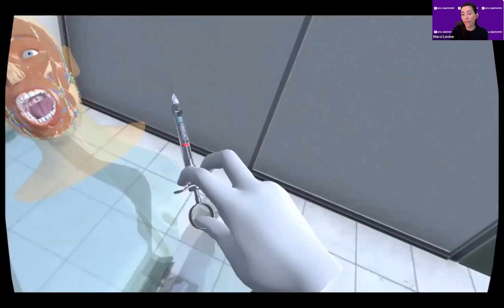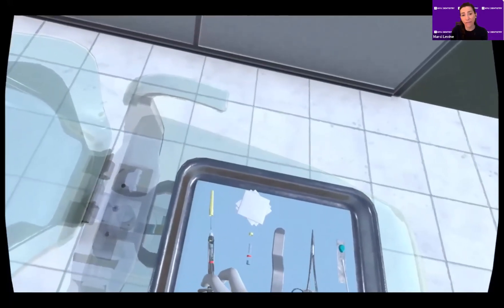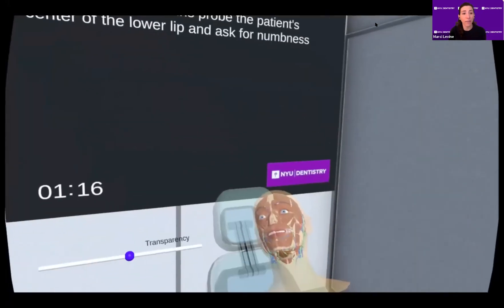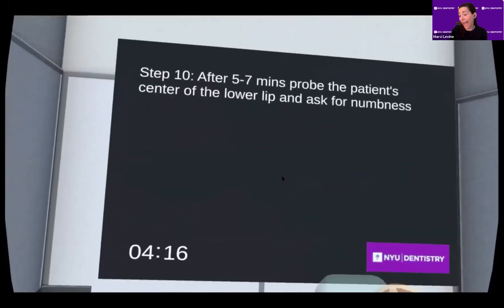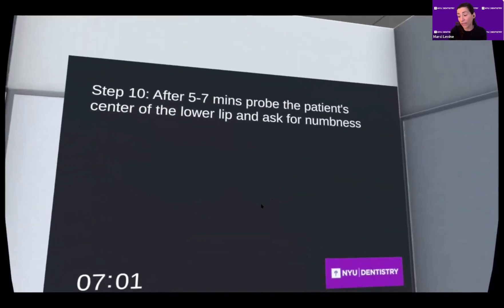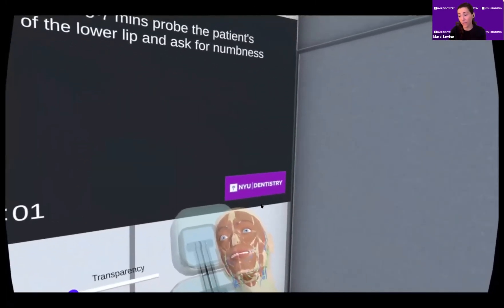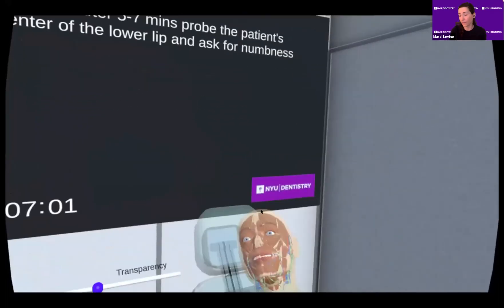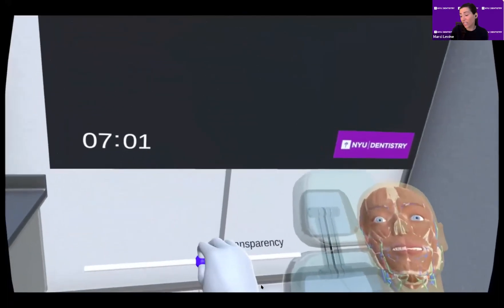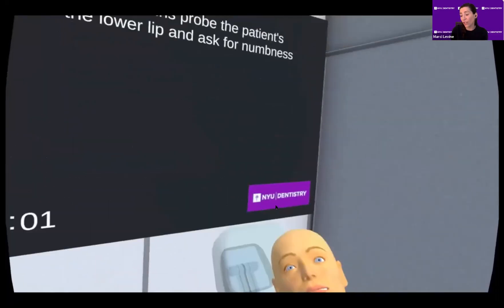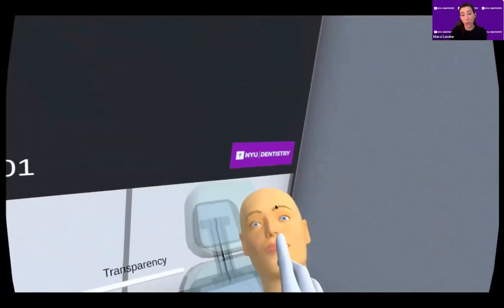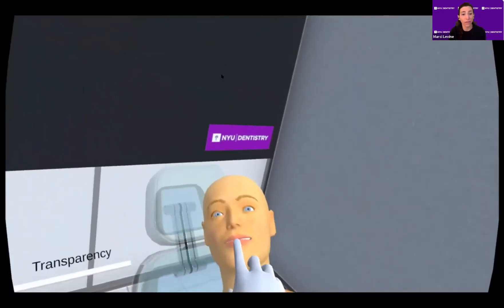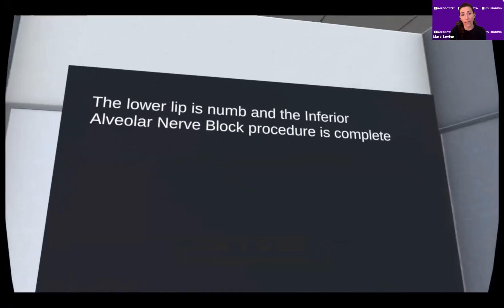Just like in real life, we emphasize recapping safely with a one-handed scoop technique. To simulate the time it takes for the local anesthetic to act, the clock advances quickly for the purposes of this video. At the end of the injection, the user adjusts the transparency back to normal to show the skin, and after confirming anesthesia has been achieved, the module is completed.